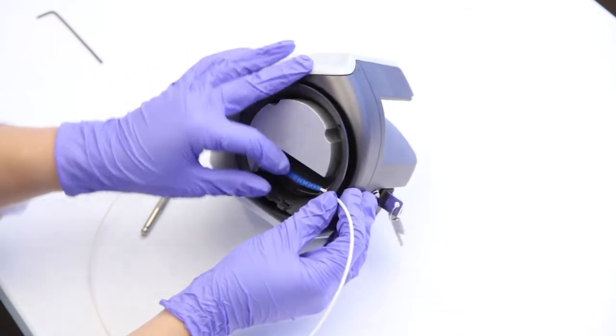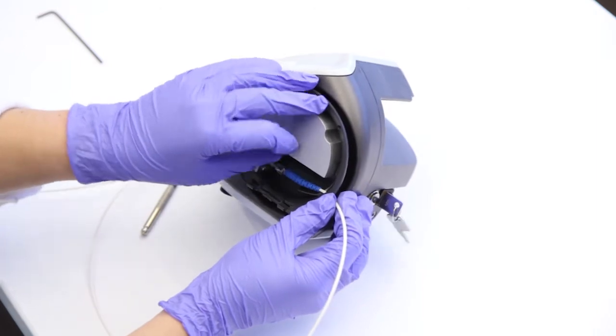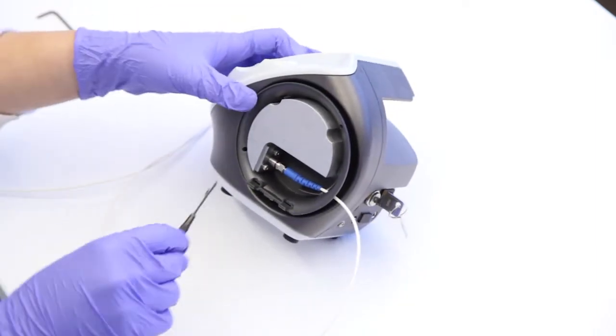Use your fingers to secure the SMA connector to the diode aperture and tighten it with the provided wrench.